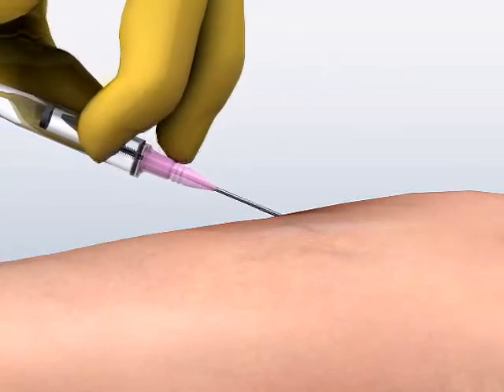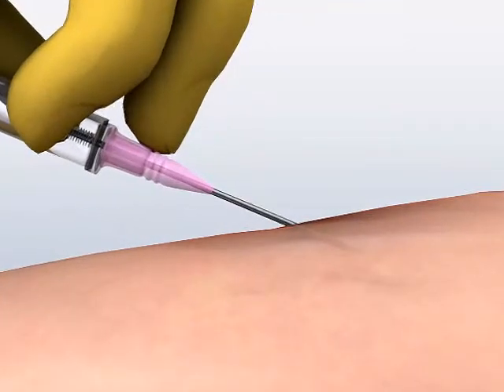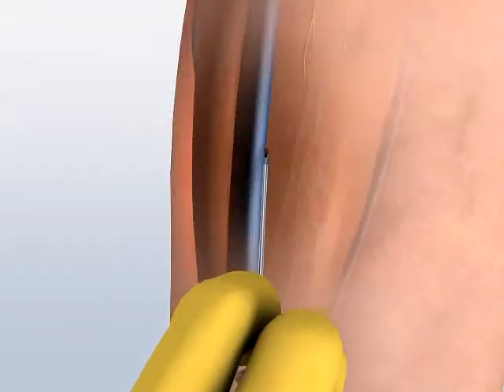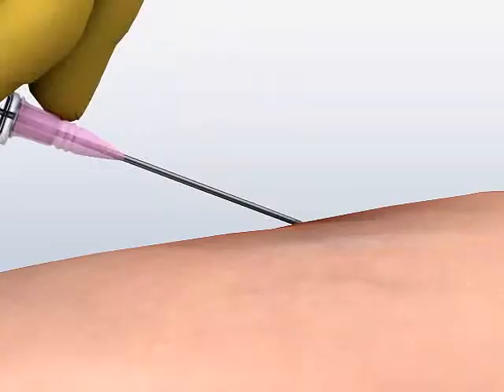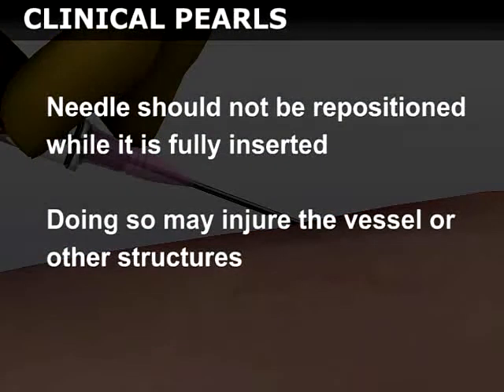If you do not obtain a flash of blood on the initial catheter advancement, the needle needs to be repositioned. Gently withdraw the entire catheter assembly so that just the tip of the needle remains under the epidermis. Change the angle of entry by a slight amount and then re-advance the catheter. The needle should not be repositioned while it is fully inserted, as doing so may injure the vessel or other structures.